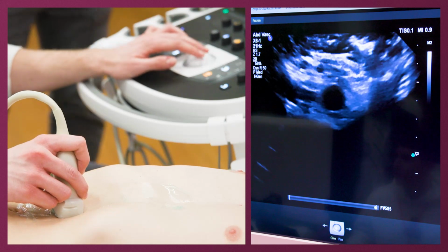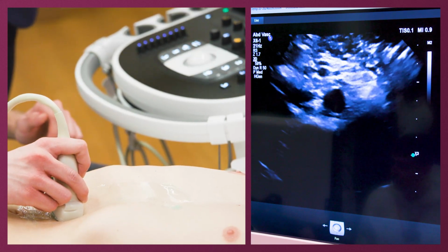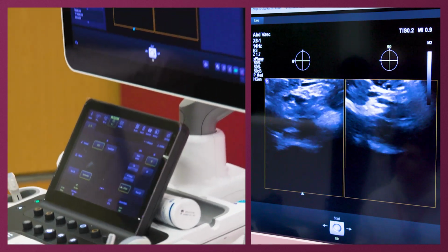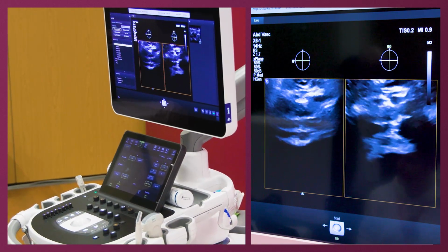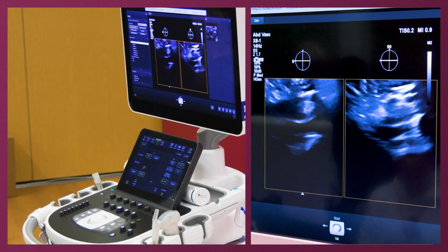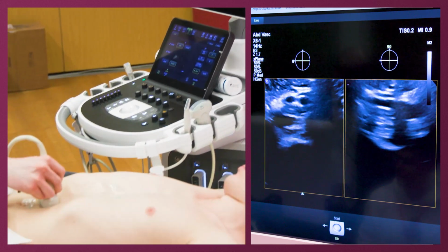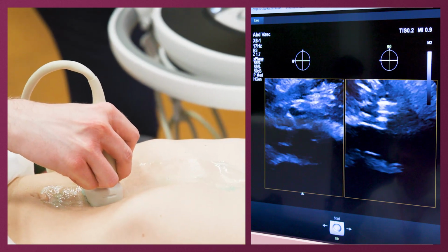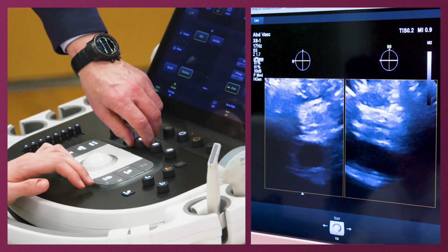Maybe you should just, for fun, try to use this X-plane, so you can try this strange sensation that you have two planes. You need to master two planes. It doesn't matter if I do it like this. And you can adjust it as any image you like to.